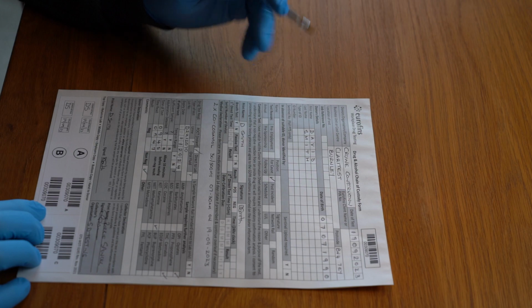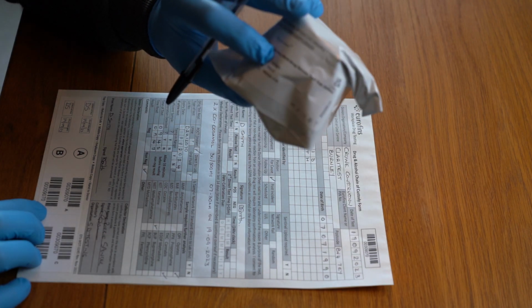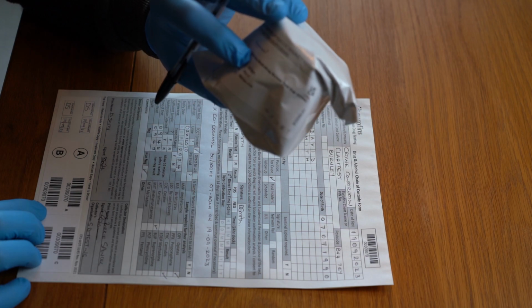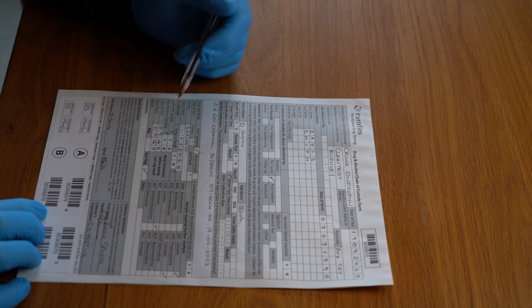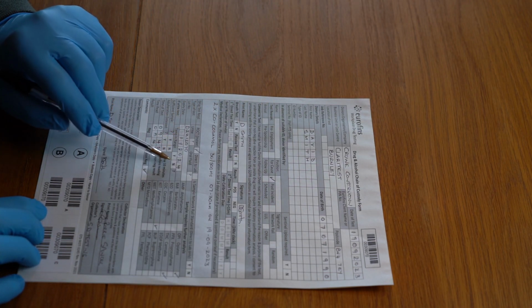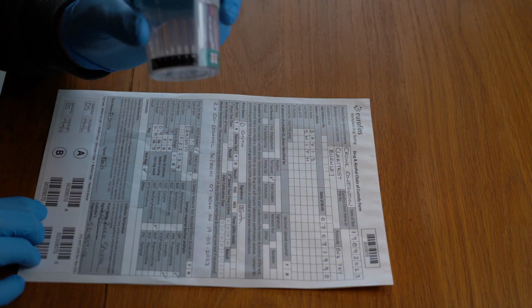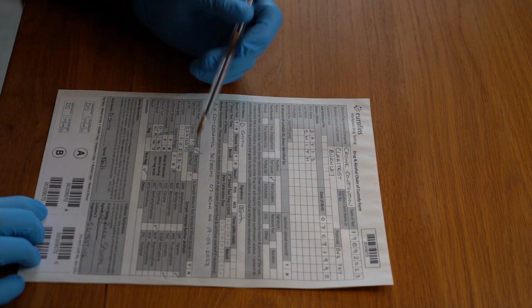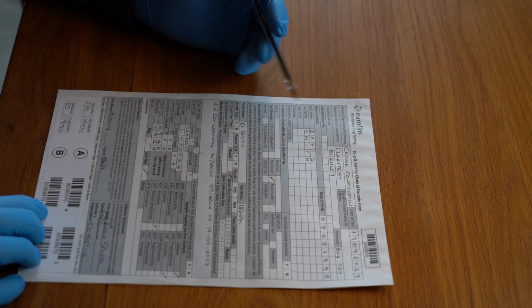You then come back to your initial test that you did, whether it was urine or saliva. This was a urine test, so I simply wrote the details from the test kit, your point of care test, or otherwise known as POCT. I wrote that onto the form, so I wrote the lot number and expiry date. If it's a urine test, you'll need to say whether that urine was in temperature range, and if you remember when we did these tests, you would have looked at the thermometer on the front of the kit, so you can say that it was in the temperature range of between 32 and 38.